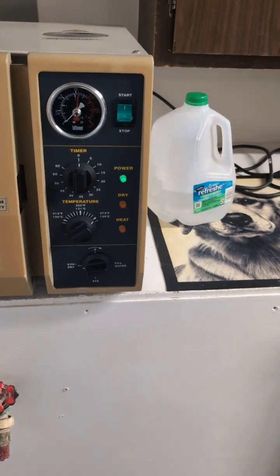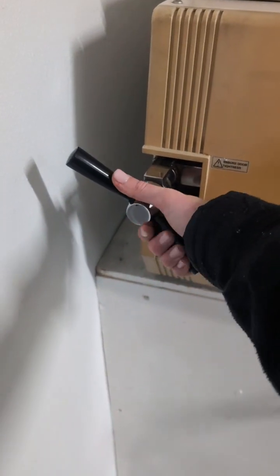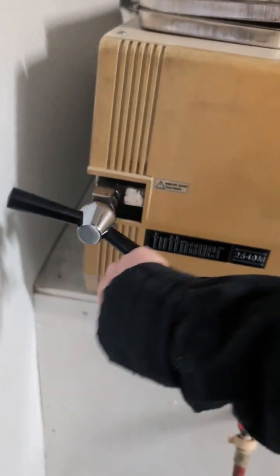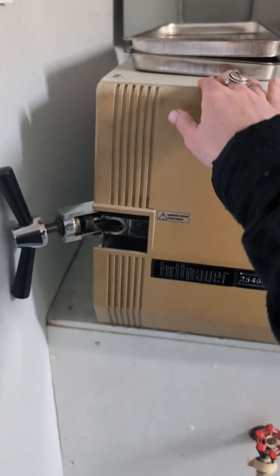Okay, so after it has finished with the exhaust, I will turn this to 0, turn this off. And open the door.